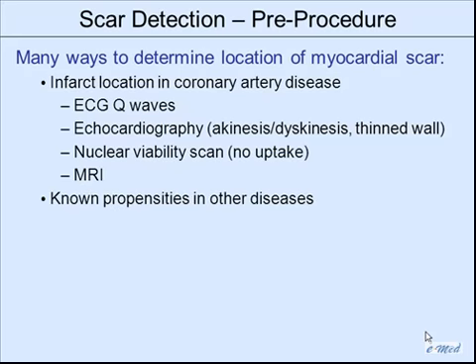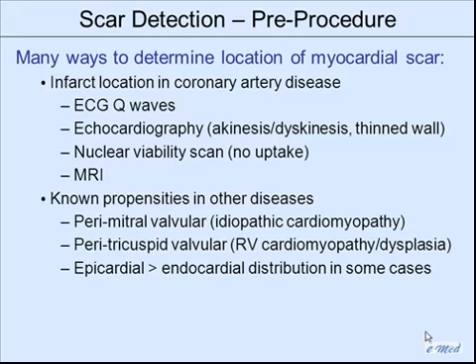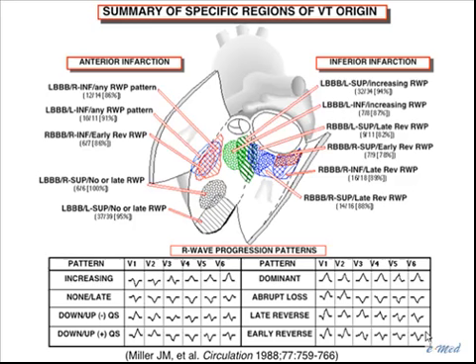I don't know how comfortable your radiologists are at using MR in people with devices. Ours are still not very comfortable. We're trying to help out with that, but it's still an uphill battle. And then in other situations with different distributions of scar and so on. This is from one of my friends. This is a patient with subendocardial and epicardial scar as well, and a patient with extensive anterior and inferior injury, and a lot on the septum as well.